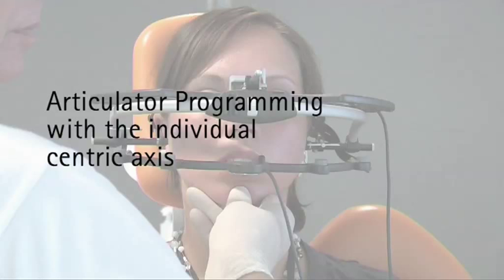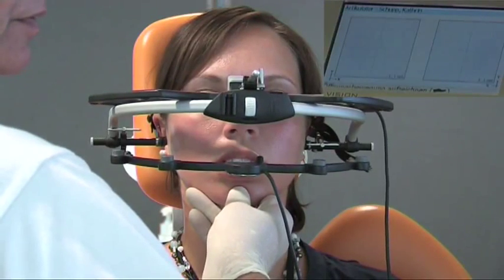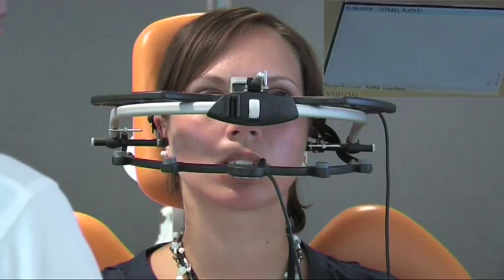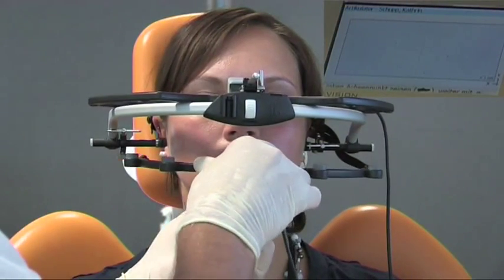The measuring is started. Please open and close, and once again open and close. Measuring is ended and the measuring bow is removed.